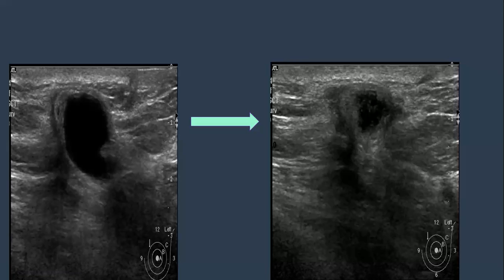Surgery on fibrous tissue is liable to be. There is distortion here. Look for the distortions. Distortion and increased echogenicity. Yes, the seroma cavity or the central part is getting less, but getting heterogeneous, and even look here within, getting thick wall. The wall is getting thicker.